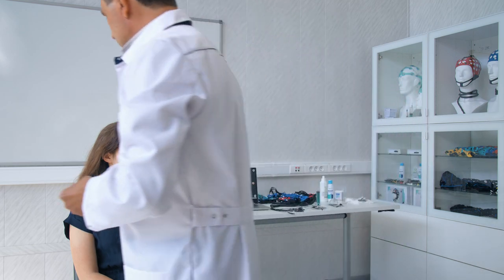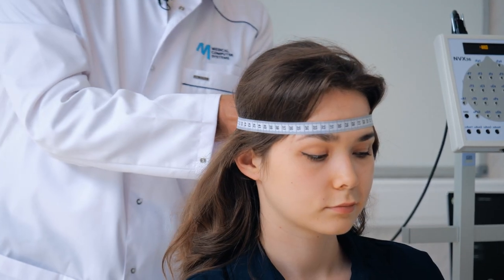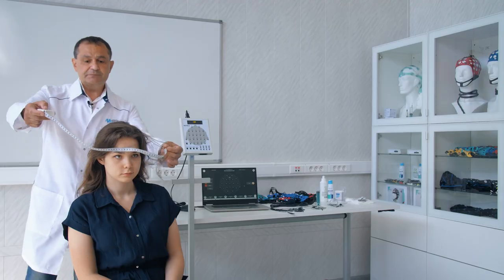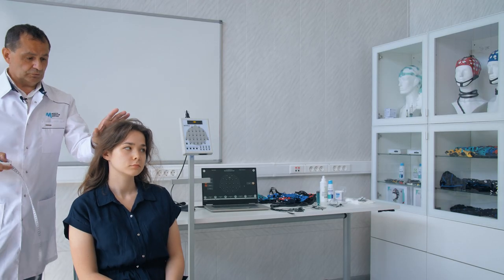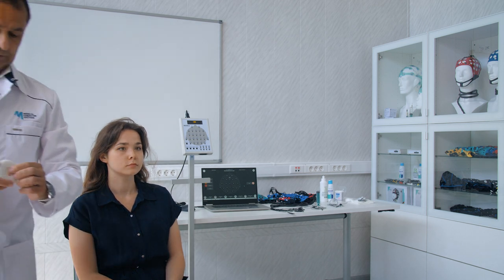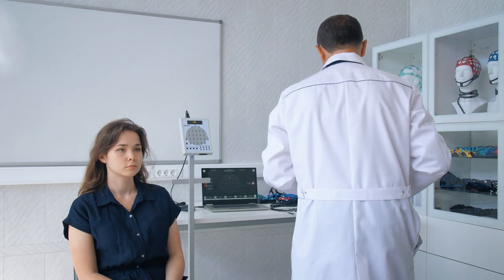Before starting the procedure, the patient must be informed to prepare. The head should be clean, and it is preferable to neaten up the hair as much as possible. We measure the circumference of the head — here we have a measurement of approximately 60 centimeters. Considering that the subject has hair, the actual head circumference is estimated to be approximately 56–58 centimeters.